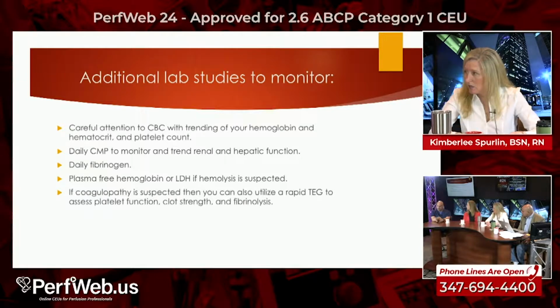Absolutely. I think that is a test that is underutilized. I understand not every hospital has the ability to run one, but it will save you money, time, and patient care if you can say exactly where the angle is and what your waveform looks like. And they're not expensive at all. I know part of it is time, penny wise, pound foolish.